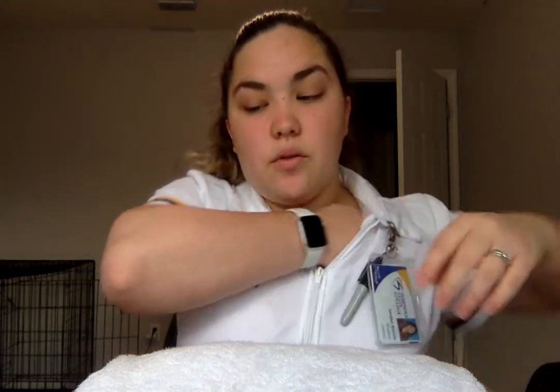And then I'm going to do the same thing with the vitamin B12. I'm going to scan her armband, and then scan the medication, and do started. And then, like I said, position her how I want her. I'm going to have her sitting up. I'm going to use this as my fake patient right here. So this is her arm right here. For the IM injection, we're going to use the Z-track method. That means I'm just going to displace the skin to the side, go in at a 90-degree angle, and then inject.